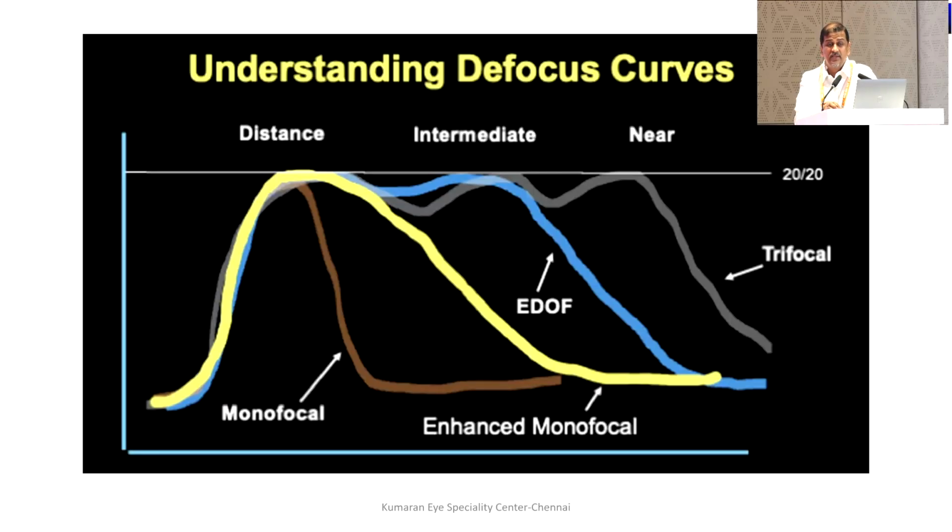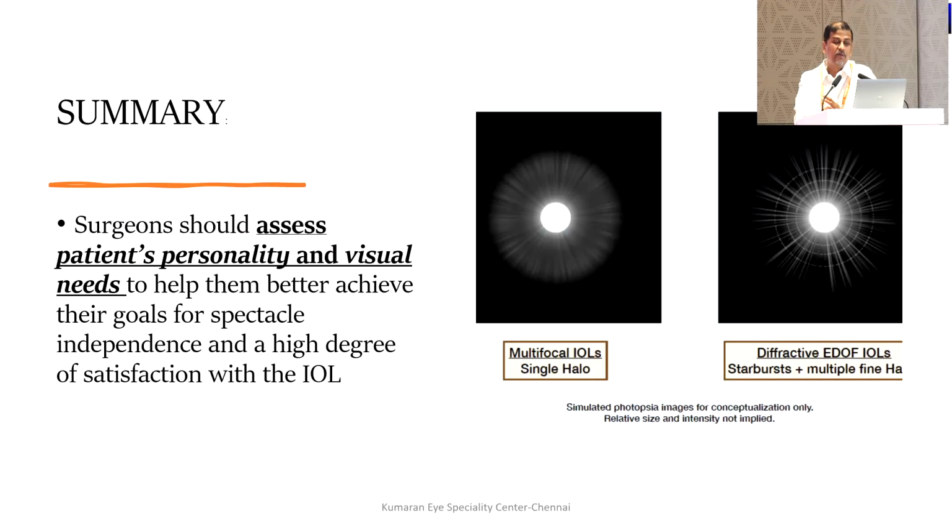But these lenses are very safe when you're looking at a patient who's very demanding or who is an active driver or a younger patient. The trifocals give a good range of vision for all these distances, and they do well in a person who's going to confine to the household and just wants spectacle independence for the daily routine work.